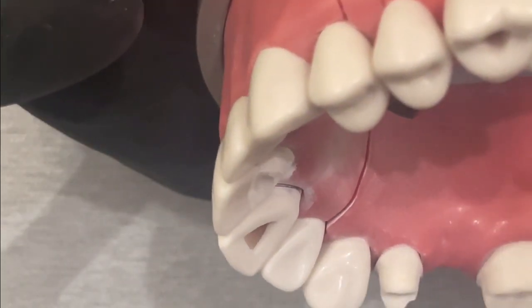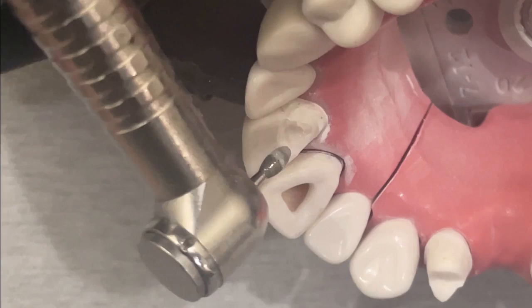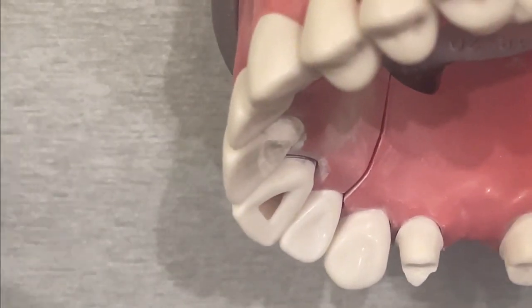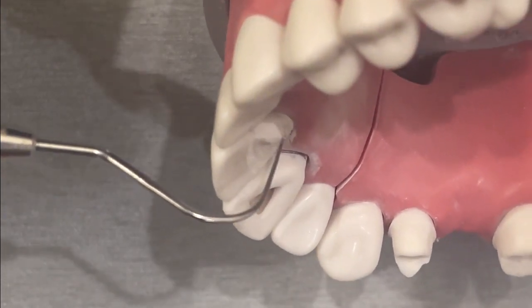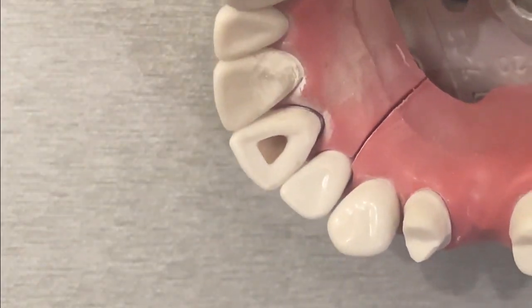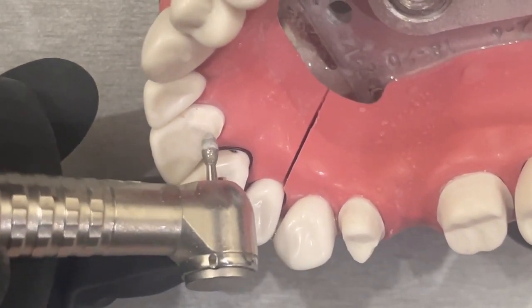I've almost made like a hole in the tooth. If you follow the steps correctly, this part should have been done already, so you'd just be joining it and avoiding this last little drop. As you can see, I'm forcing this shape of the cingulum — it's dropping in, then it's flat a little bit, and then it drops down. I'm forcing it to have a cingulum when the tooth itself is extremely flat, like a ski slope.